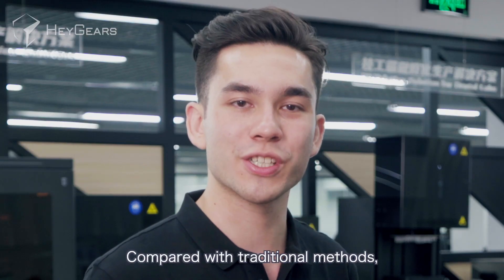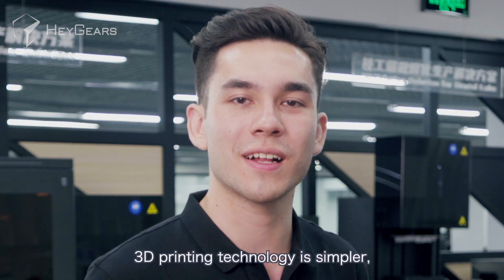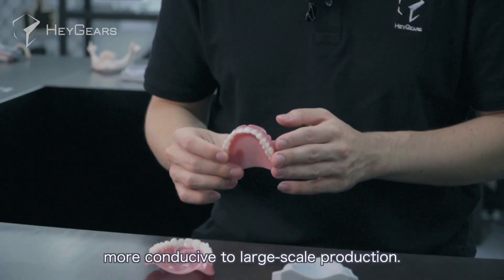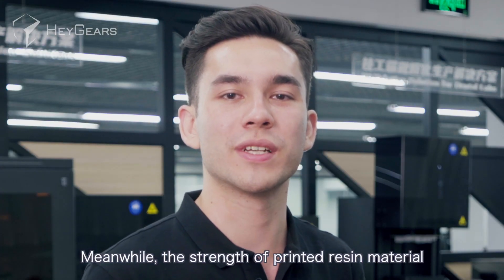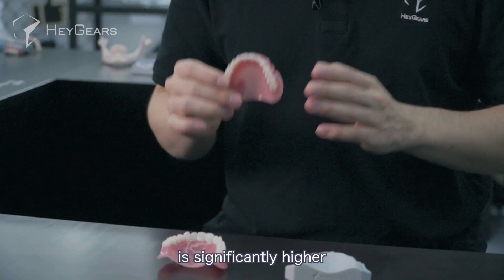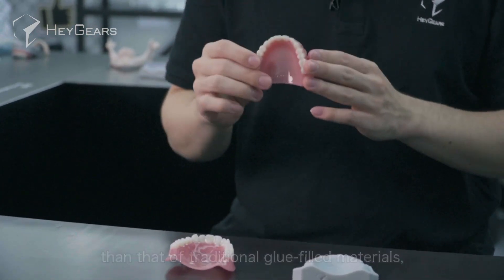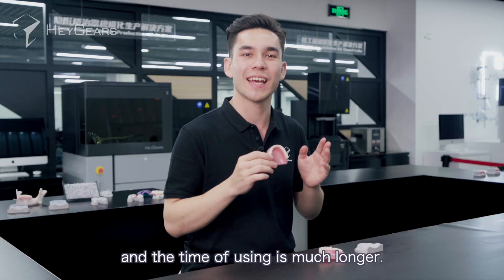Compared with traditional methods, 3D printing technology is simpler and the processing is faster, more conducive to large-scale productions. Meanwhile, the strength of printed resin materials is significantly higher than that of traditional glue-filled materials, and the time of using is much longer.